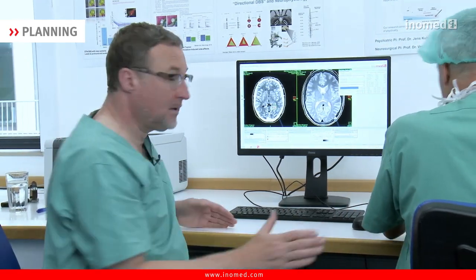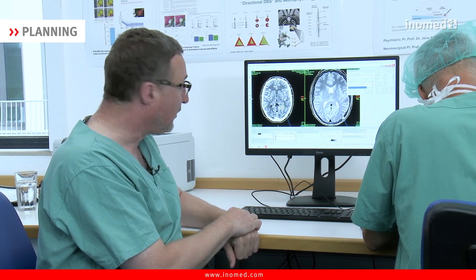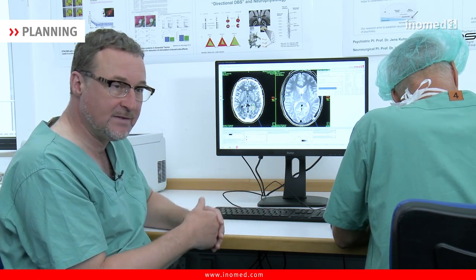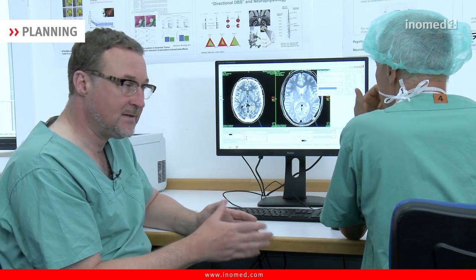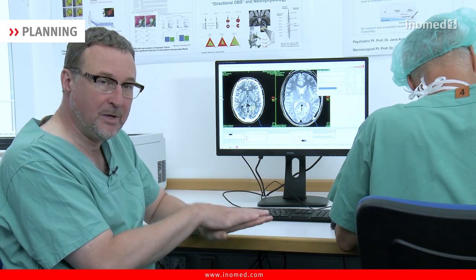Now we enter the hot phase. The pre-planned brachytherapy plan is transferred to the current CT, and we check whether the access we have chosen with our catheter is still optimal. The question is whether we need to reschedule, because vessels are in the way or whether the contour of this tumor may have changed. The already pre-planned plan is now checked with the current imaging to see whether we can proceed as originally planned or not.